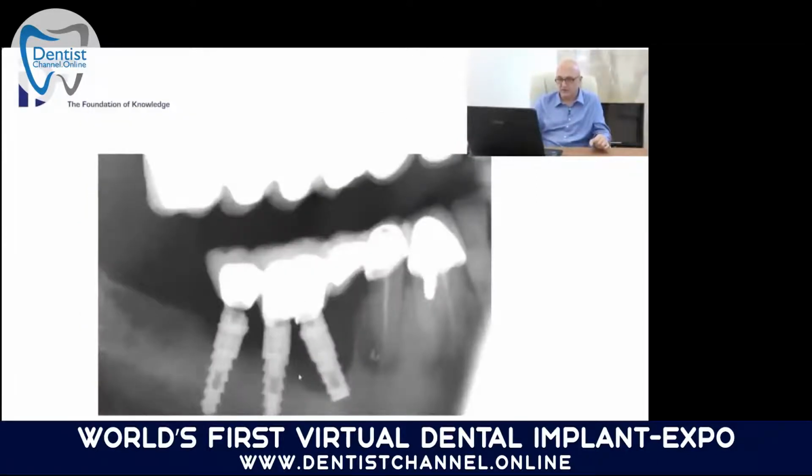Similar situation here, a lot of bone loss around this medial implant. These are also blocked together. I mean, they're not single crowns, but they are blocked. And this, of course, is over-stiffening the bone. You could say this is like the stress shielding effect in fracture plates. And this always leads to a loss of bone. I will show you later on an example of the stress shielding effect in a hip implant. You see exactly what you see here, you will see on the hip implant also.